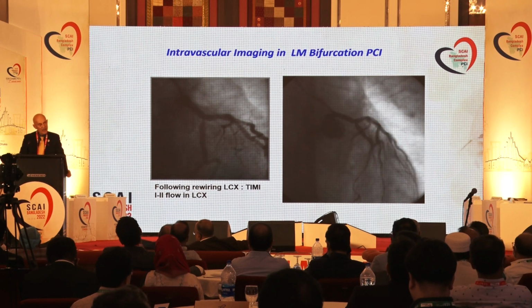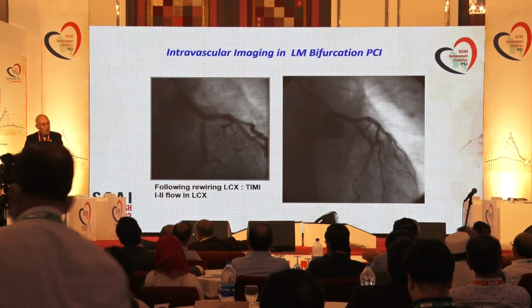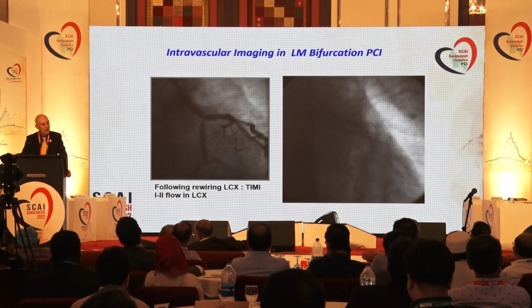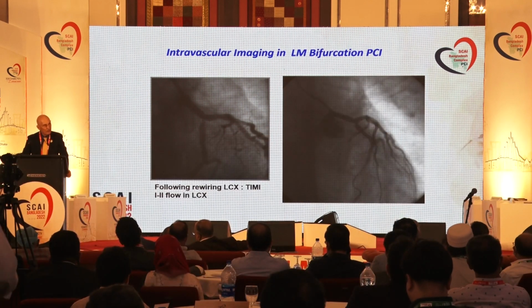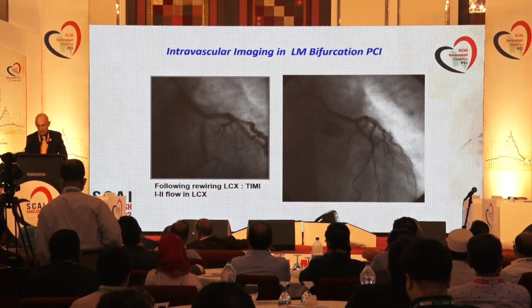And this is what happened after stenting the vessel. You see now we have a tight lesion on the circumflex, but we do not know whether it is dissection, whether it is shifting of plaque, whether it is thrombus, and so on.